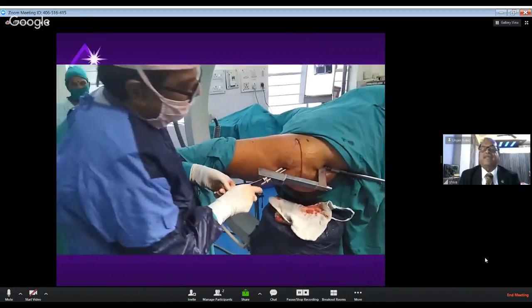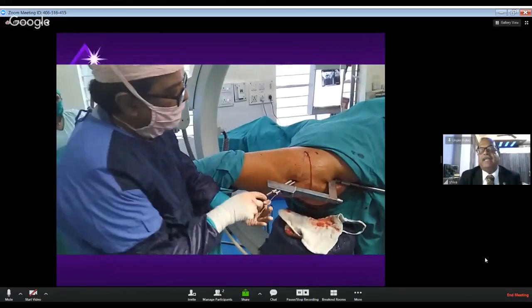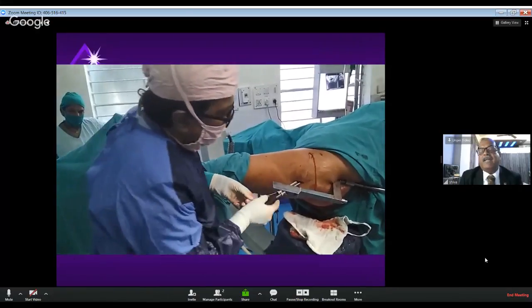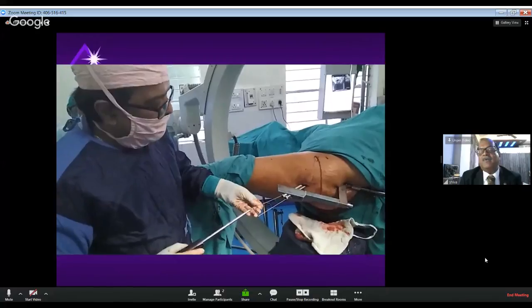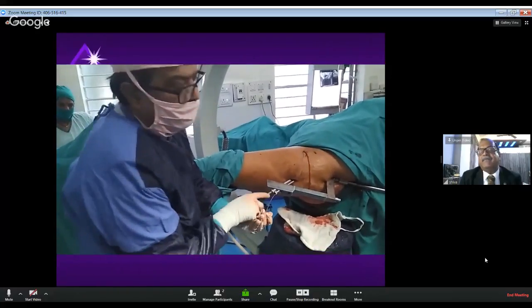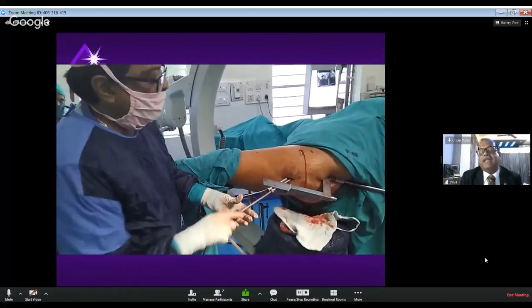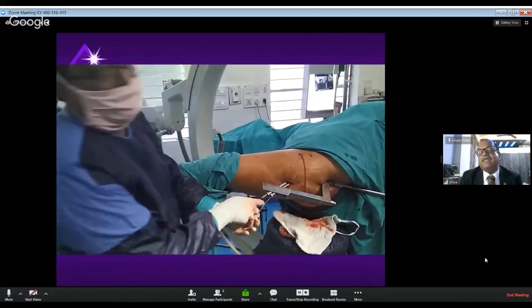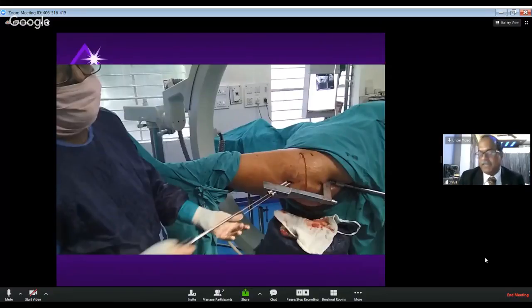How to compress? I have already passed the derotator. I have released the traction at the fixation, and now I am alternately compressing the fixation screw as well as the cervical screw. As this is a PFN, a two-screw system I am using, I am alternately compressing till I am satisfied. Once I am satisfied with the amount of compression achieved, I will stop this. So this is the advantage of a PFN. You can compress as much as you want. If you want 5 millimeter, you can compress. If you want 6 millimeter, you can compress. If you want 10 millimeter, you can compress, till the time you feel that the fracture is well compressed.